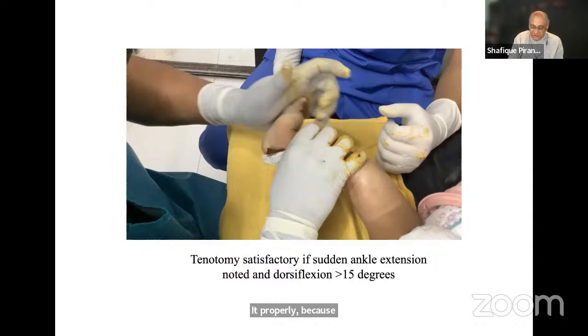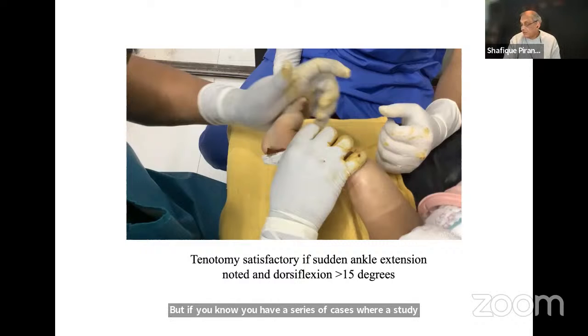Because the collagen, I don't know this for sure, but whatever the contracted posterior medial retracting fibrosis is, the pathology in the arch of the foot is the same as the pathology of the collagen, or possibly posterior medial to the ankle joint. But if you have a series of cases where a study was done and say 3 or 4 casts were applied and the cavus didn't correct, then of course one could make a very strong argument.